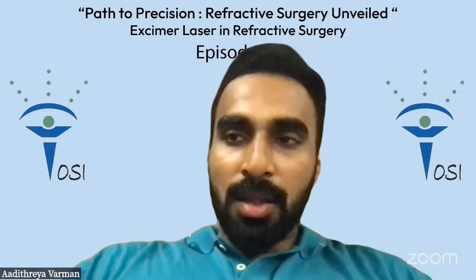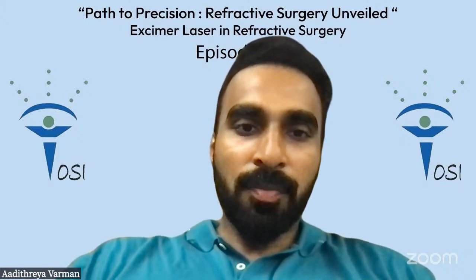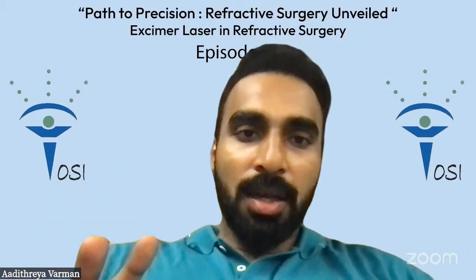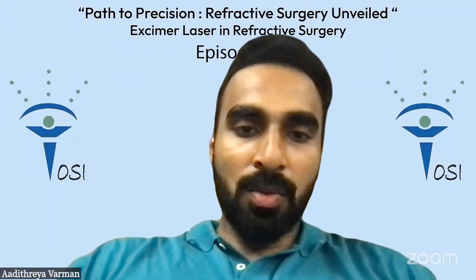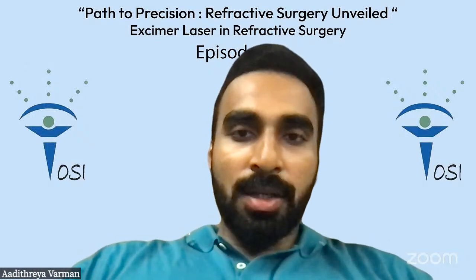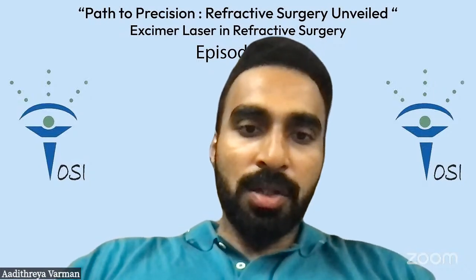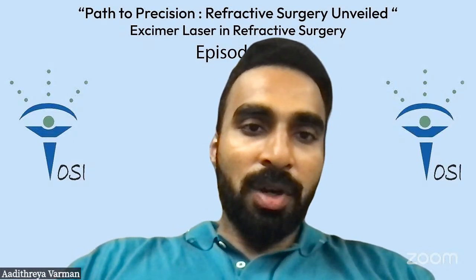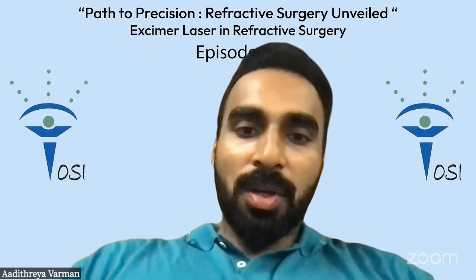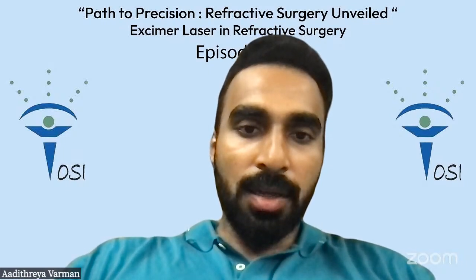In the last 2 years, of the 1,700 SMILE cases we've done, I've had 2 cases of ectasia that came after 1 year. Both of them were low myopia with normal corneal thickness. They were not the cases where you would expect ectasia to happen. All the cases I treated for high myopia, where I was a little nervous about ectasia, are doing well. But this patient had a 520 cornea, normal topography, and for minus 1.5 diopters she developed ectasia. So I think for things like this, we need to look further and dig deeper.